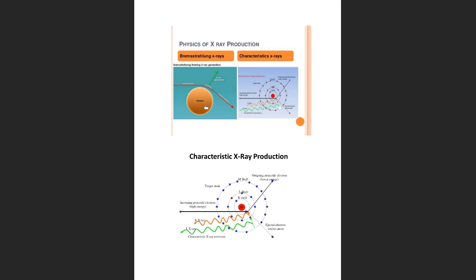All right. Okay, so here all I did was give you, and if you watched yesterday, you've seen these images. I just gave you a side-by-side comparison because, you know, Miss Ray can't draw. So just showing you that it passes by the nucleus, and it's just slightly affected. You see, it just has a little bend there, and we're talking about a low energy X-ray that is being produced. The more it passes closely by and stays closer to it, the more it would give off a higher energy BREMS X-ray photon.